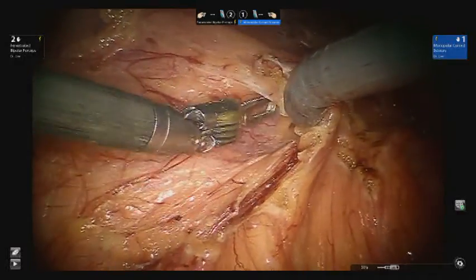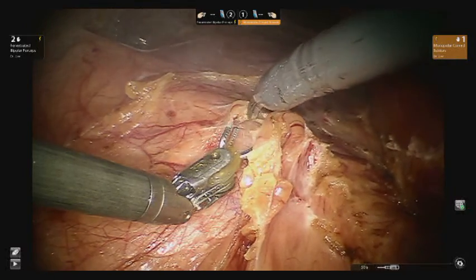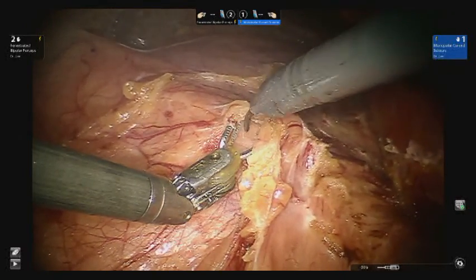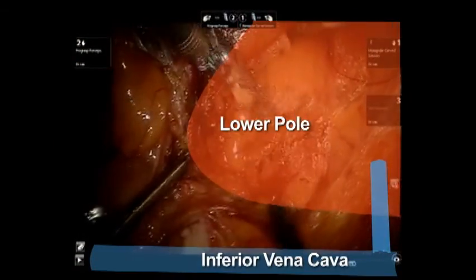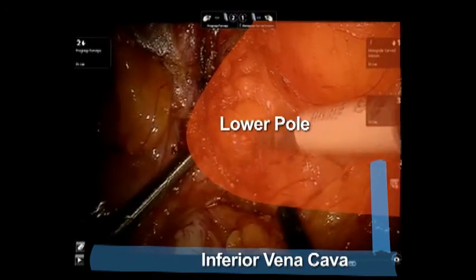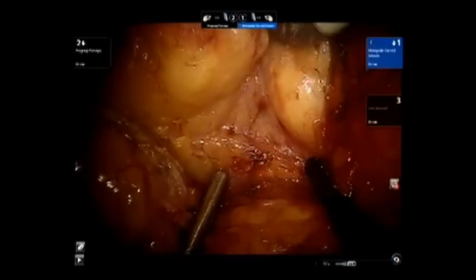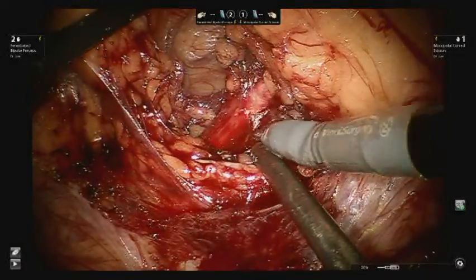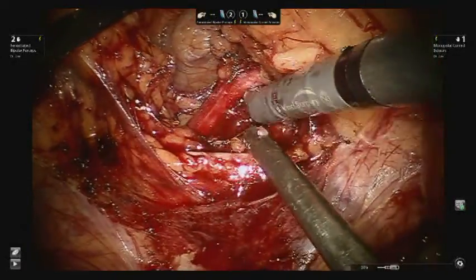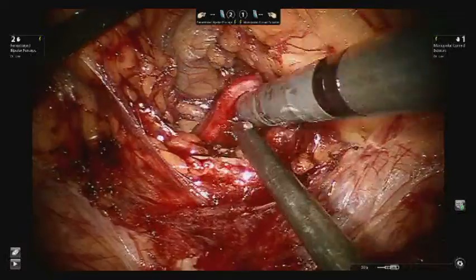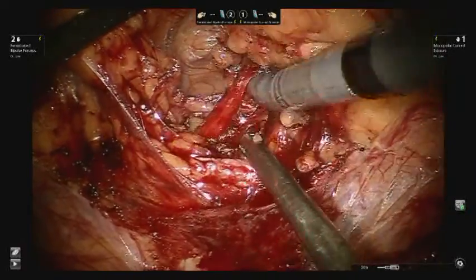The colorenal ligaments are divided further, mobilizing the colon to facilitate exposure to the renal hilum. A window is created between the lower pole and the psoas, and the kidney is elevated by the assistant using non-traumatic graspers. The ureter is isolated and elevated with the lower pole by the assistant, using caution not to devascularize the ureter with excessive dissection.